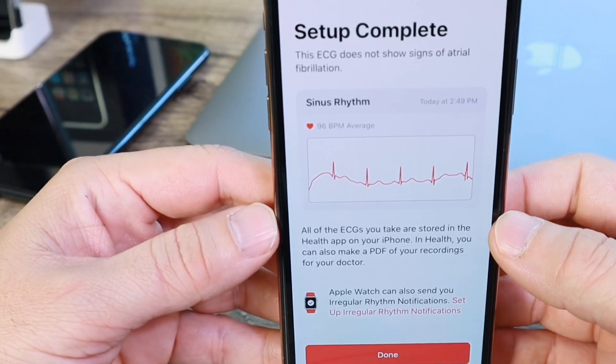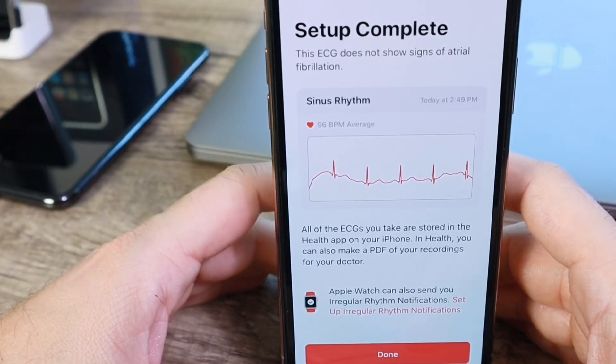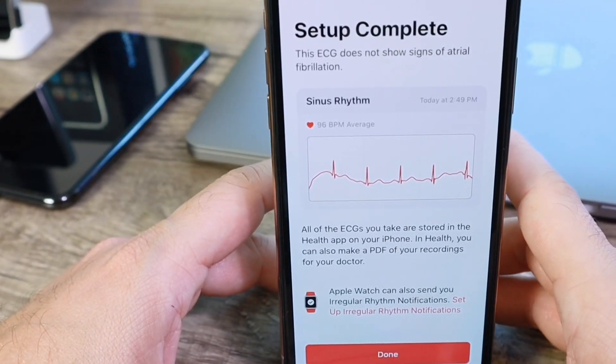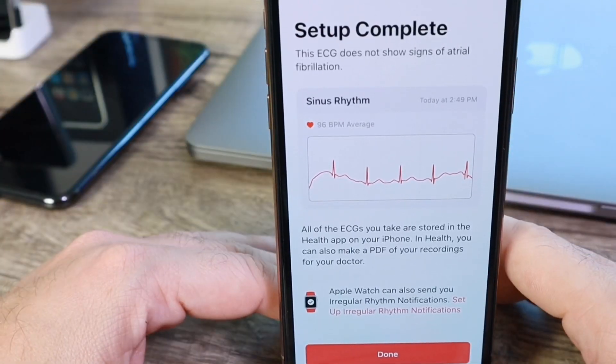After the first setup you get a full breakdown of the information that the Apple Watch is providing. This is magnificent — a major breakthrough for the health industry, for the evolution of the Apple Watch, and for technology in general.